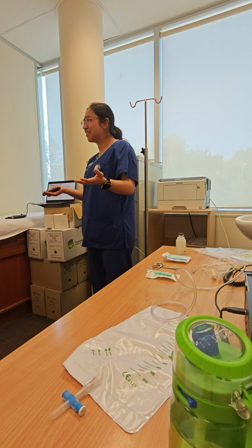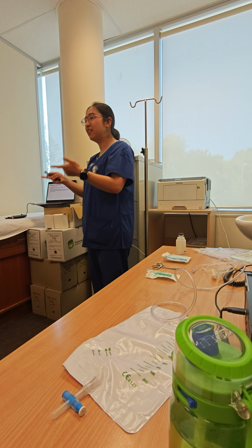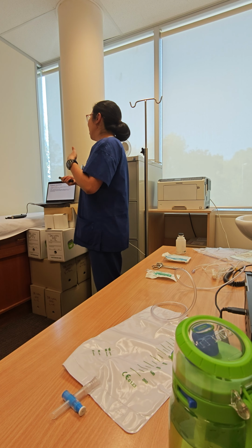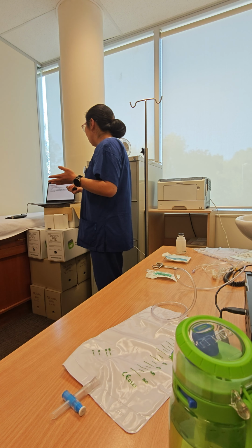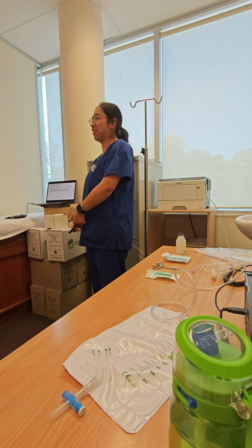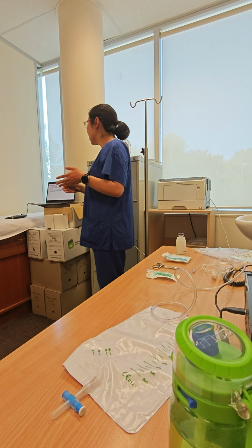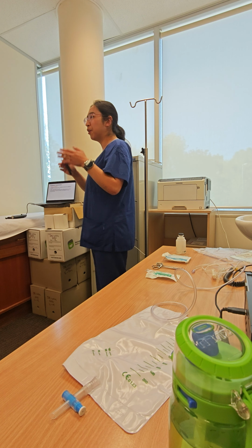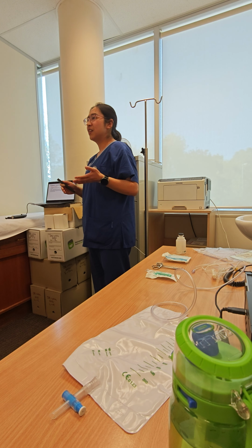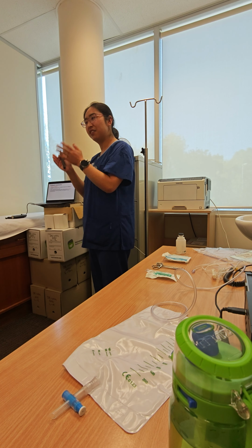But how can we see the bladder in the X-rays? We use contrast dye to highlight the bladder in the pictures. Thus, we can use these pictures to evaluate bladder cancer, bladder polyps, or vesicoureteral reflux, which means the urine flows back from the bladder to the ureter. That's a kind of disease. But our cystogram case study is a post-prostate surgical cystogram, so it's a little bit different. The main aim is to evaluate if there is any leak in the bladder.